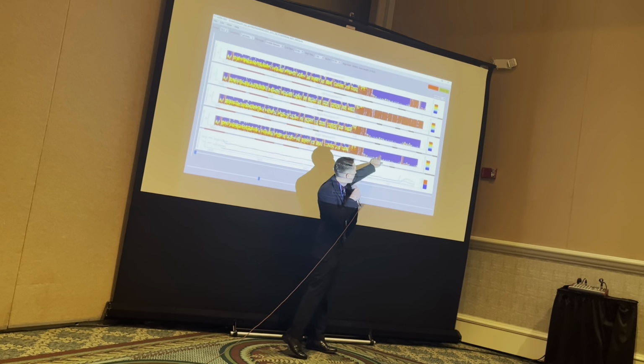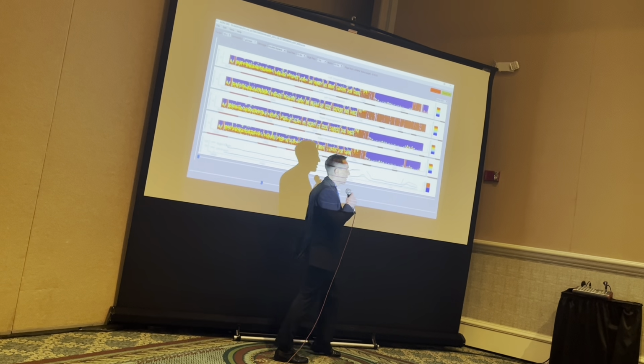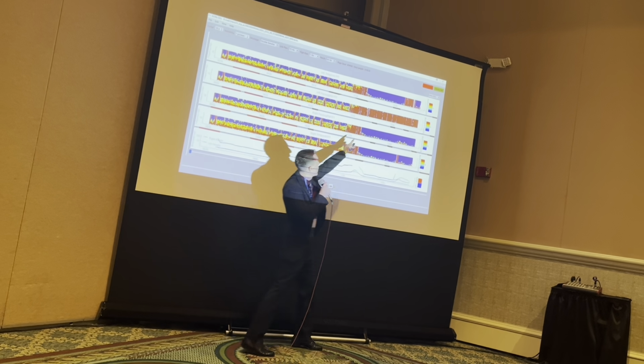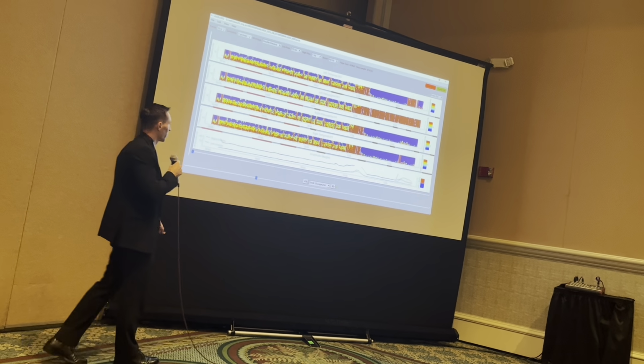The reason for being all blue here and here and here is because the wires actually came off the patient's head during the generalized tonic-clonic seizure, because those can be pretty intense, that's for sure. And in this panel, it's all red, that's just artifact, because the wires are just off the charts going crazy.